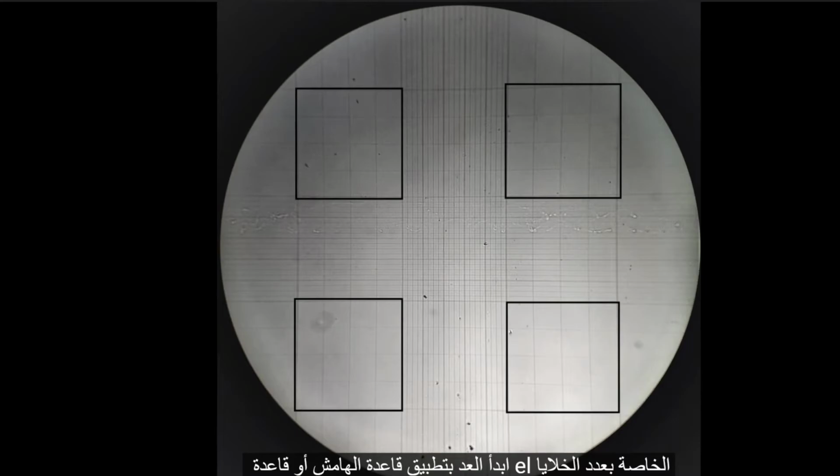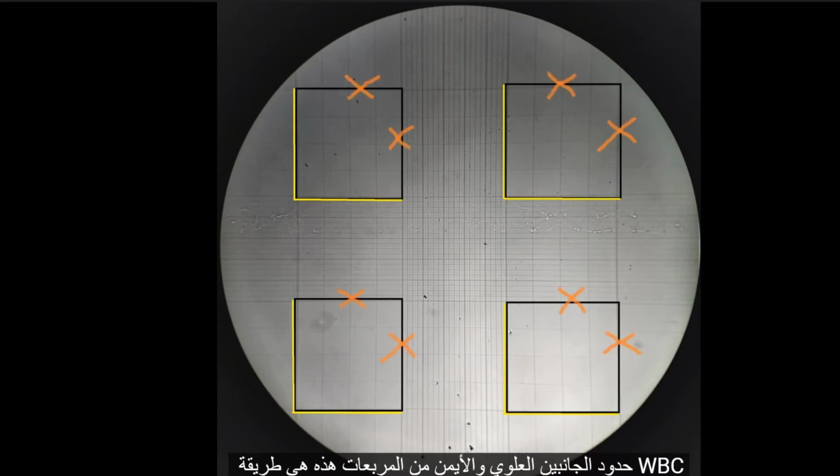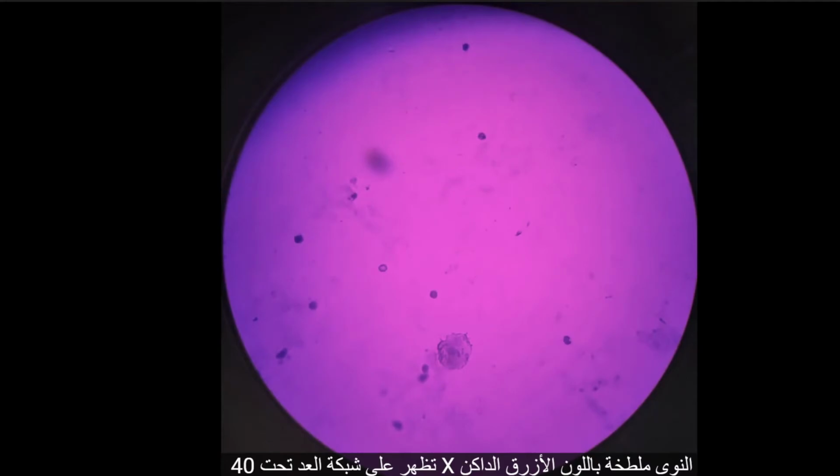Applying the margin rule or L rule of cell counting, count the WBCs lying inside of these squares and those lying on the borders of the lower and left side of each square. Do not count those cells lying on the borders of the upper and right sides of the squares. This is how WBCs will appear on the counting grid under 40x. The nuclei are stained deep blue against a violet background.